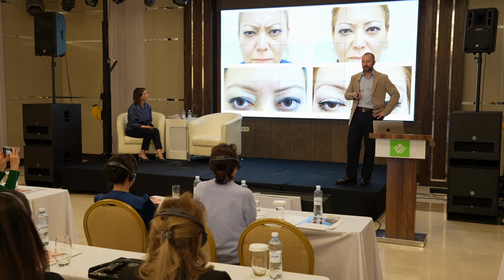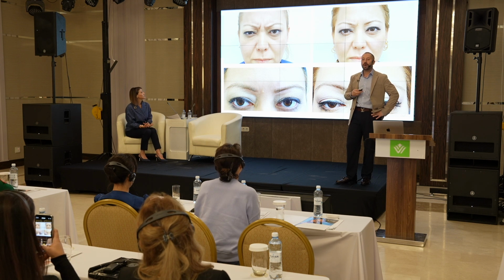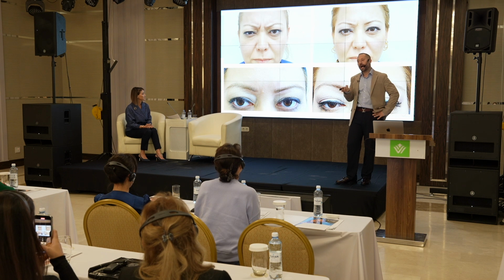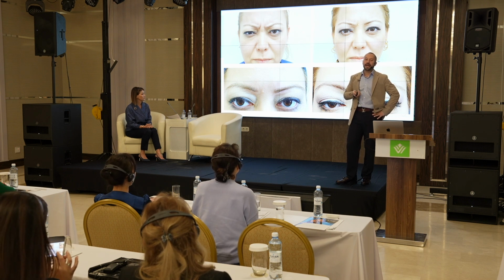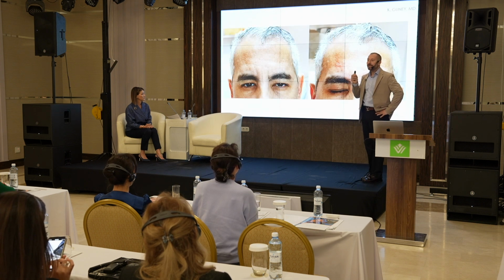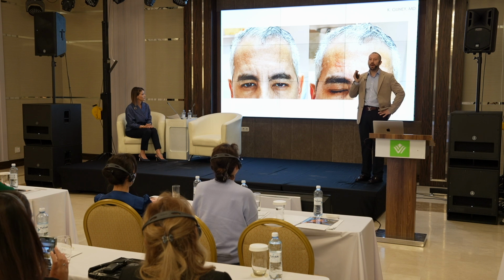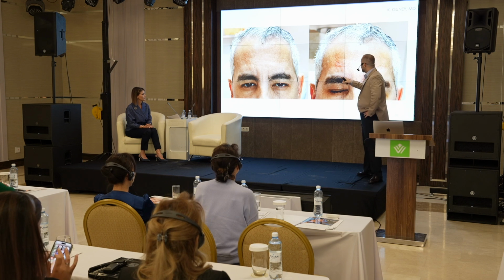So, of course, the first choice is toxin. Sometimes toxin doesn't work or the patient doesn't want it. You can use an alternative, or toxin and hyaluronic acid together in these lines. You can also use RHA 1 on the whole face with this blanching technique, for all the wrinkles, with superficial injections.